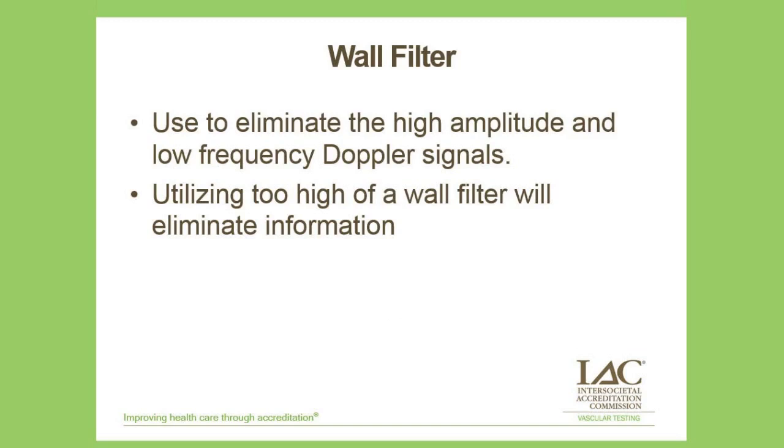When using our wall filter, you want to make sure that you're not using too high of a wall filter to eliminate information. We use it to eliminate the high amplitude and low frequency Doppler signals.